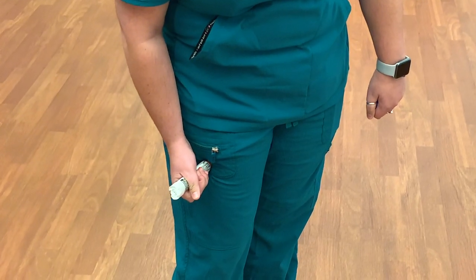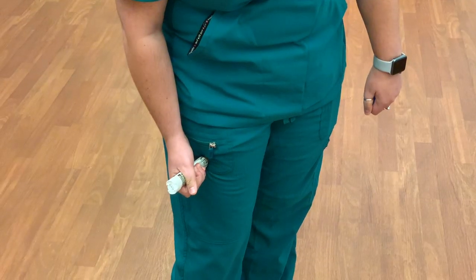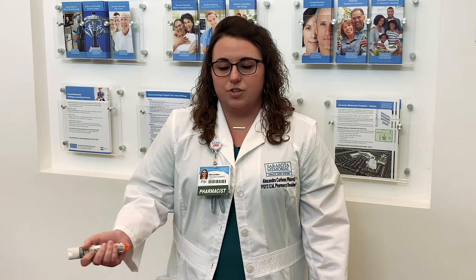Once you hear that click, you will wait 10 seconds, holding it there with the needle in, and then you'll pull back and pull it out. When it pulls out, it'll actually cover the needle, so you shouldn't have any sharp objects there. But just to be cautious, just in case it doesn't automatically cover the needle.